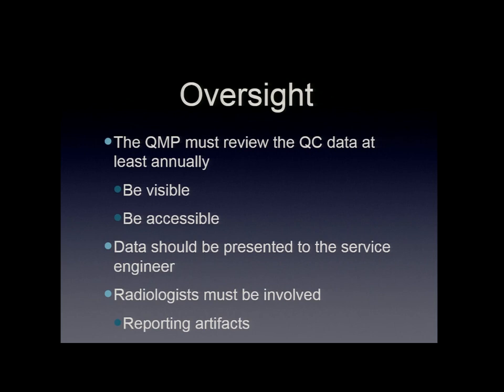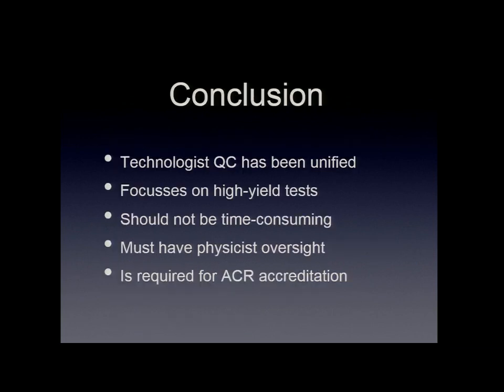The data that we have, the data in the QC, should be available to the field service engineer that comes in. So they can say, so what are you talking about? What numbers did you get? What protocol did you use? And then they can evaluate that so that they can approach it to help resolve it. And as I said, the radiologist needs to report anything they see during their reading.